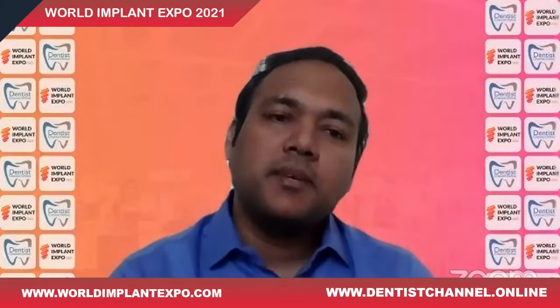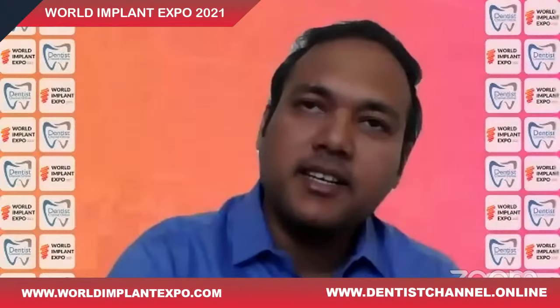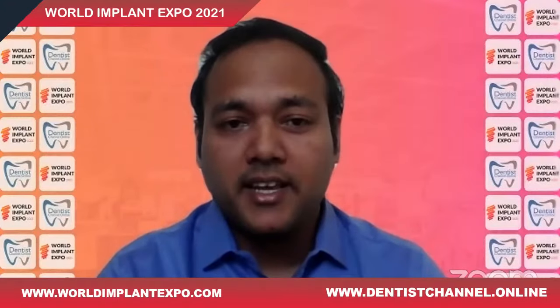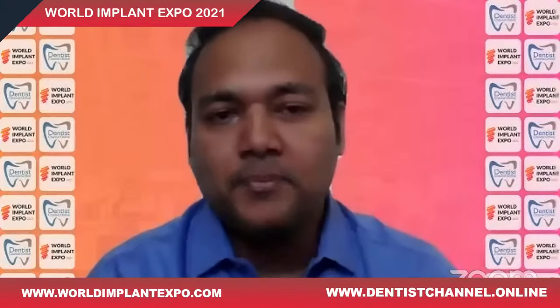Once the implant is placed, the recommended post-operative investigative modality, if it is CBCT, is better. As in one of my slides I've clearly depicted, an implant that has been placed functionally great can actually be failing because it lacks the facial bone. Such a buccolingual presentation would be ascertained clearly only in a CBCT.